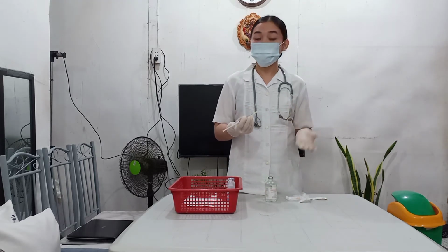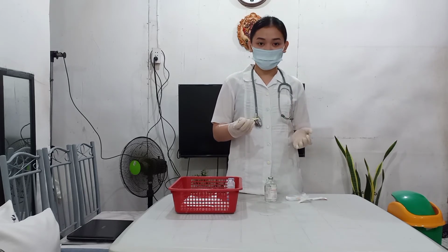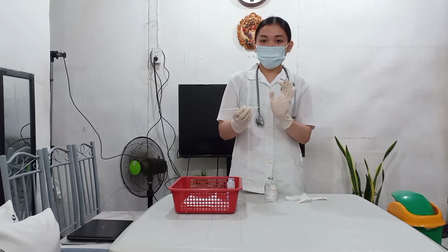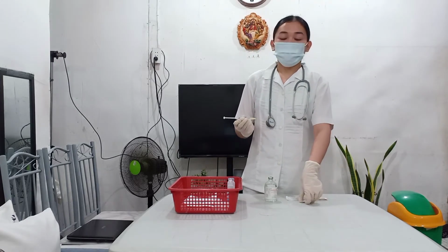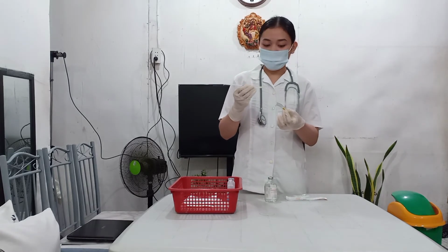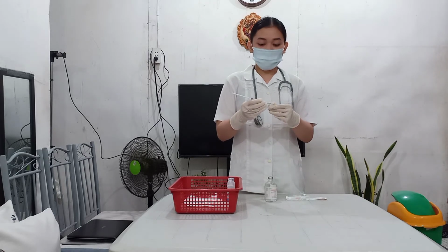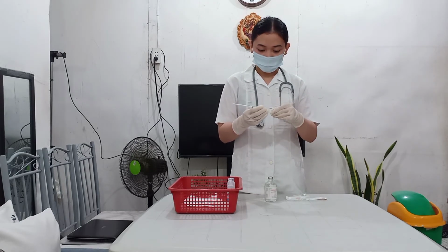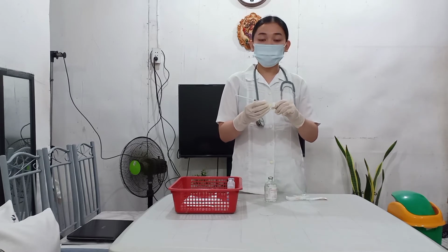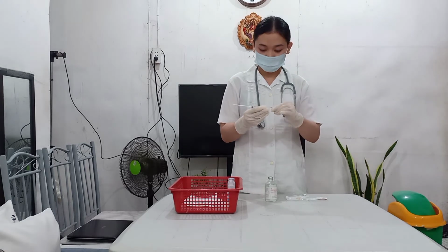So, inverting the vial prevents air from being aspirated into the syringe. After which, we will then put the filter needle into the cup again, and then we are going to remove the filter needle and then insert the syringe again to the original needle, which is used to be administered to the patient for medication.